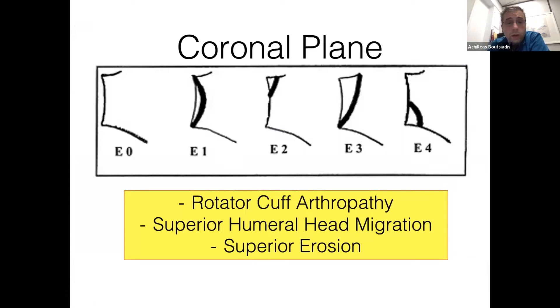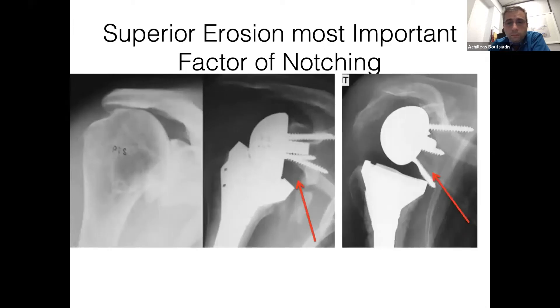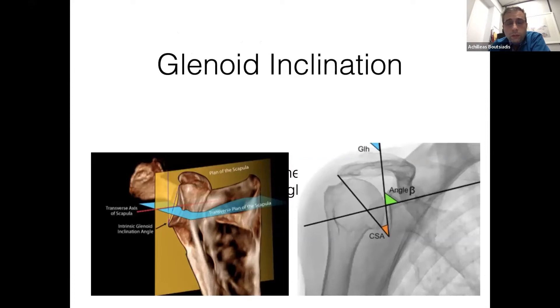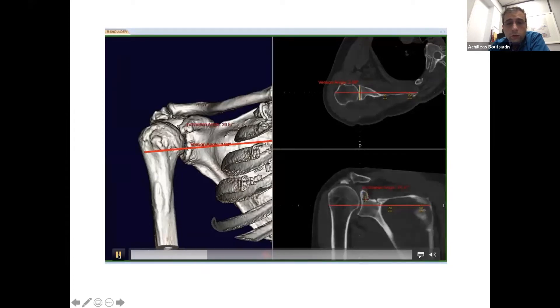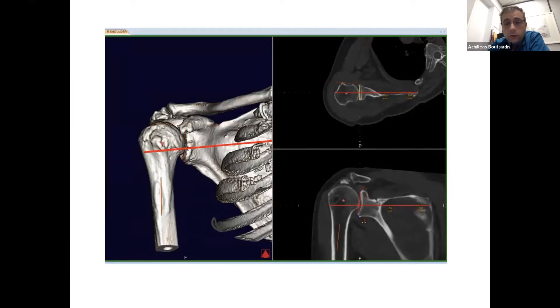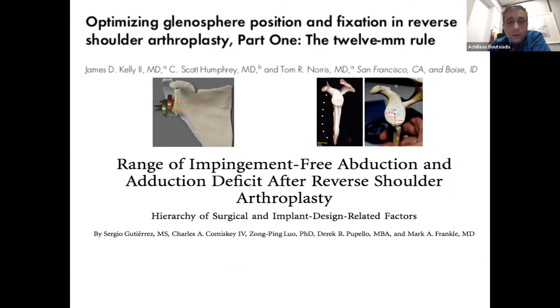In the coronal plane, in cases of rotator cuff arthropathy, we have superior humeral head migration, superior erosion, and we know the Favard classification. Superior erosion seems to be the most important factor in order to avoid notching over time. The glenoid inclination is mainly measured by the beta angle. Using the software, we can measure both the retroversion and the superior inclination. The best position of the base plate for reverse shoulder arthroplasty is on the lower third of the glenoid, with 10 degrees of inferior tilt.